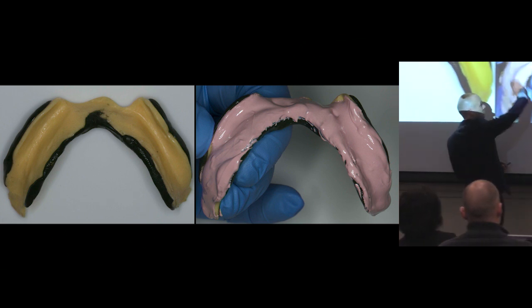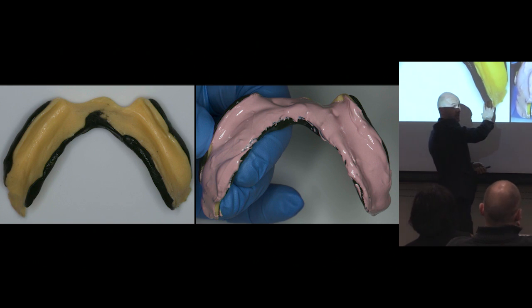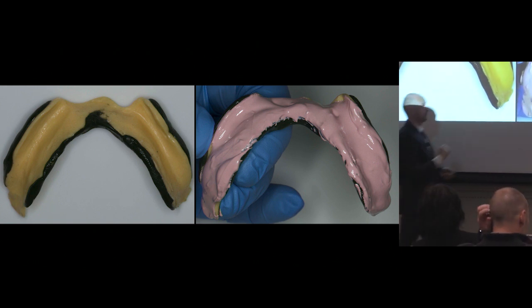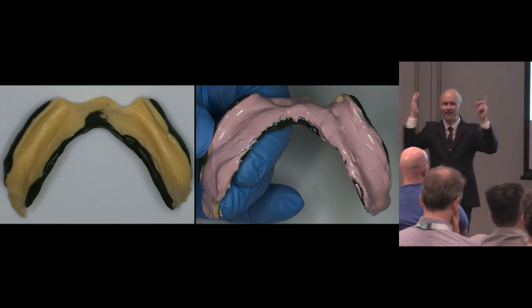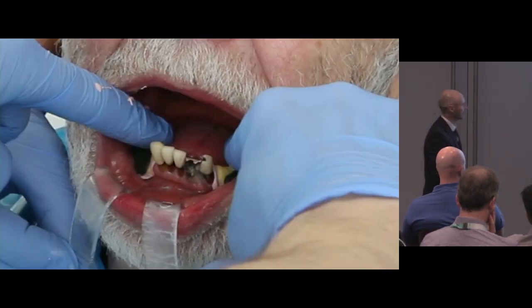So I put zinc oxide on the fitting surface. The tray's close fitting, by the way, straight onto the model. Zinc oxide eugenol. If you don't want to use zinc oxide, you can just use Impregum, it'll be absolutely fine with this. Goes into the mouth.